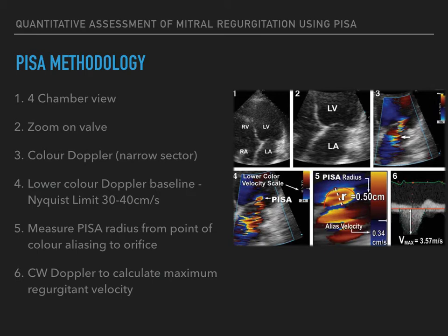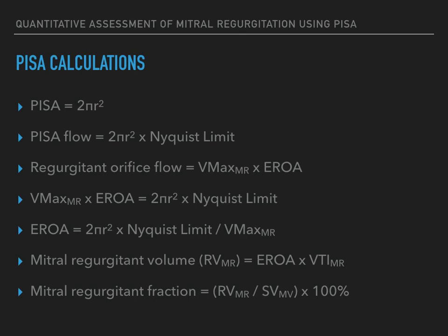Scrolling through the cine loop, the largest PISA will be found at mid-systole. The radius of the PISA is measured from the point of aliasing to the centre of the regurgitant orifice. Toggling colour Doppler off and on may be necessary to see the orifice clearly. PISA can now be calculated and is equal to 2πr², and flow within the PISA is thus 2πr² multiplied by the Nyquist limit.